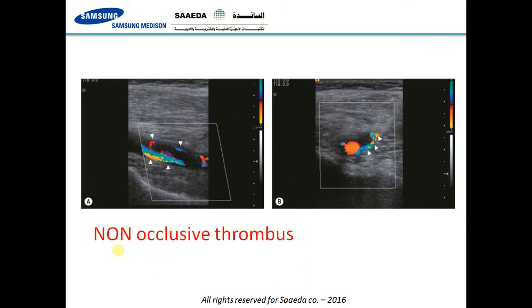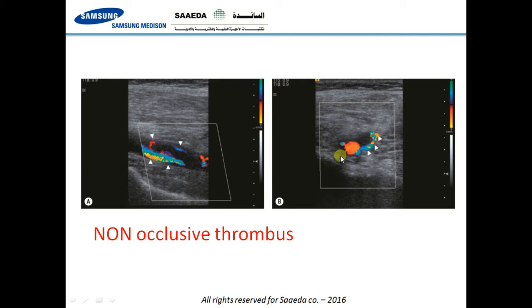Here is an example of a non-occlusive thrombus. You can see the thrombus filling most of the lumen but not all of it, and some flow still remains. In the axial cuts, you can see the artery, and the thrombus filling most of the lumen of the vein.